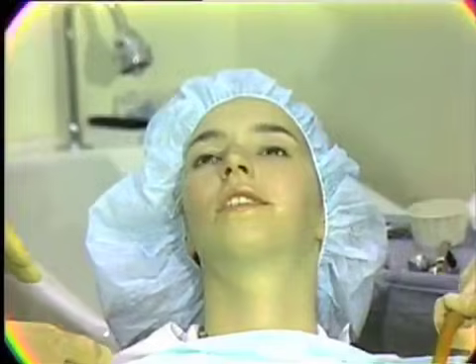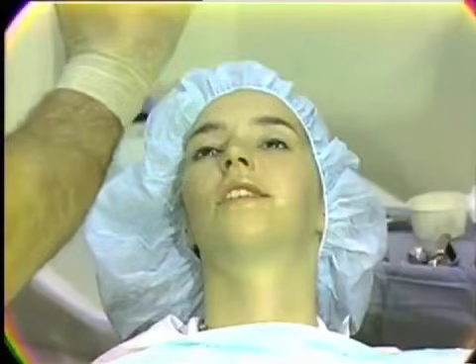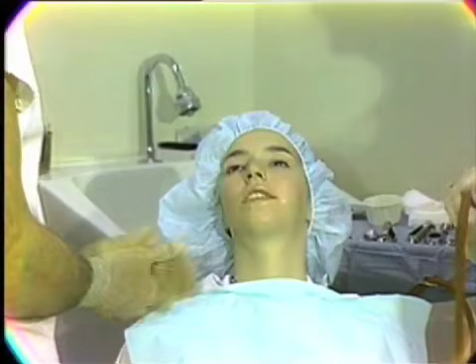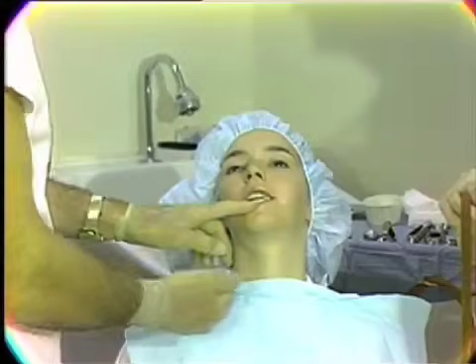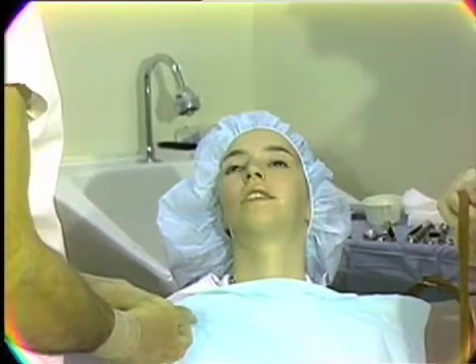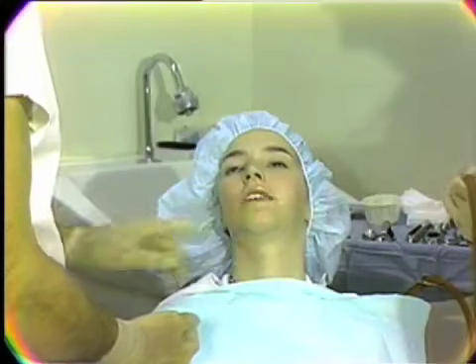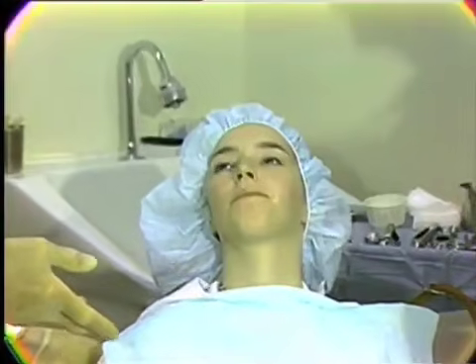The position of the operator in general should be as forward and direct as possible. We utilize direct vision in all operative fields, and very rarely do we use any reflected image in oral surgery. In the mandible, there are some instances where, in the anterior midline procedures, the position of the operator can be from the rear.